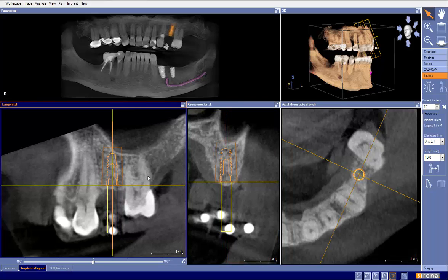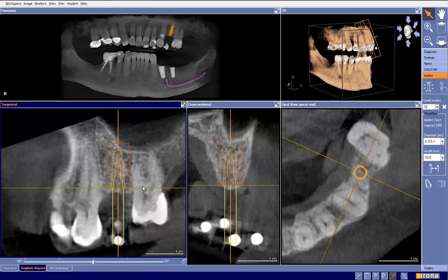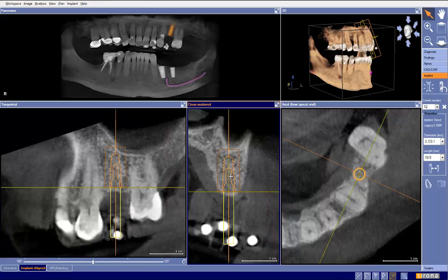So we all agree that this implant looks very well planned, but it is not very well planned based on the final restorative outcome. So if we remember correctly, on a mesiodistal aspect, we look at the bone mesiodistally, and what we're seeing is that we're separated from this root, we're separated from this root, but if we wanted to be more ideally centered, we'd probably scoot the implant over just a hair. Now, one of the benefits that's going to give us also is avoiding the sinus just a little bit more. If we look at it from a buccolingual perspective, we're perfect. The implant is exactly in the middle of the bone.